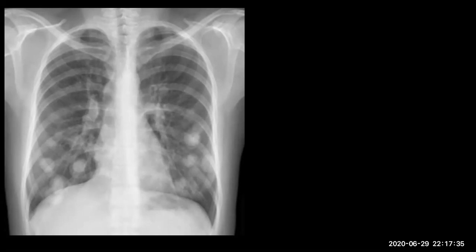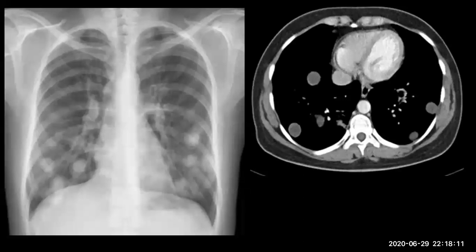Rheumatoid nodule. Other differential, vasculitis. Other differential, Wegener's. Wegener's and collagen disease, vasculitis, okay. Multiple hydatid cyst. Infection or infestation, hydatid cyst is one of the differentials. Other differential? Septic embolus. And this is the CT scan of this patient.